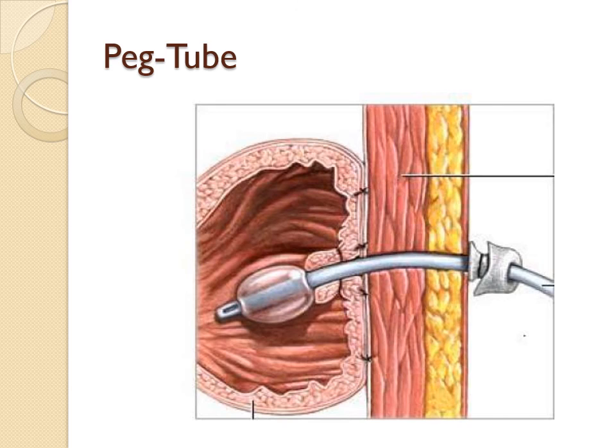If that's the case, then the tube is going to be placed just as you see here, through endoscopy, through the abdominal wall, into the stomach itself. And it's going to be held in place with a balloon similar to what you saw with urinary catheters. Therefore, it is permanently placed within the stomach cavity, and it is easy to do your feeding, as we discussed in 110 when we were talking about medication administration.